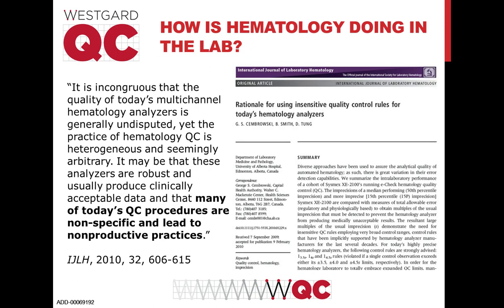So let's review a little bit about our problems specifically in hematology. What you see is a paper from 2010, so this is a little bit of a while back, but here is the sort of paradox that we find ourselves in hematology: people assume the instruments themselves are quite good, but then there's a high amount of variability in how QC is practiced, and a lot of practices that are not considered ideal.